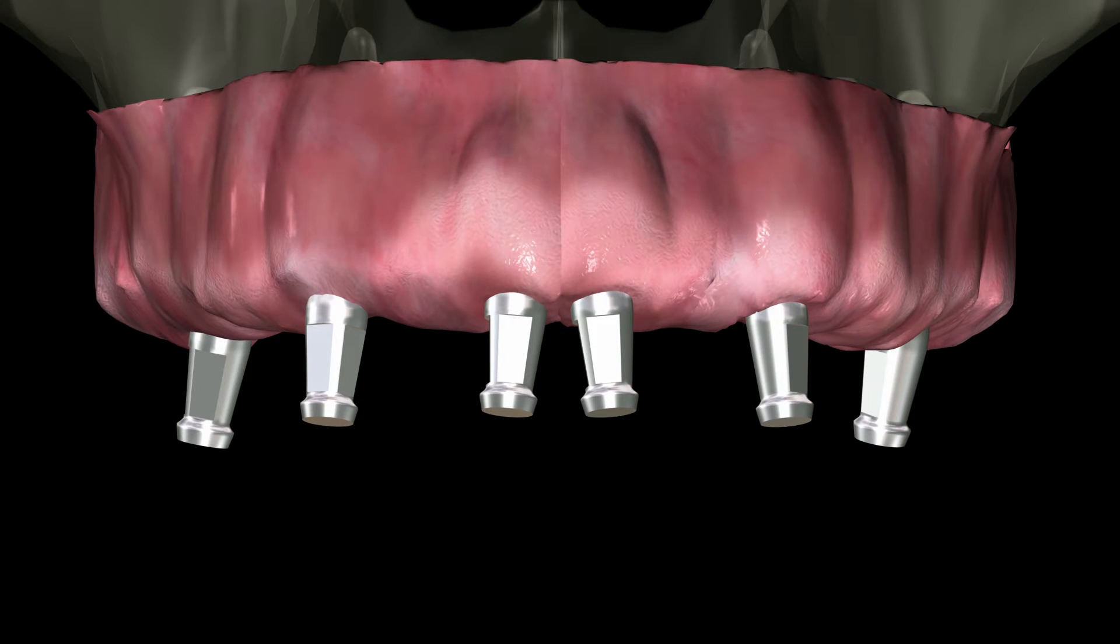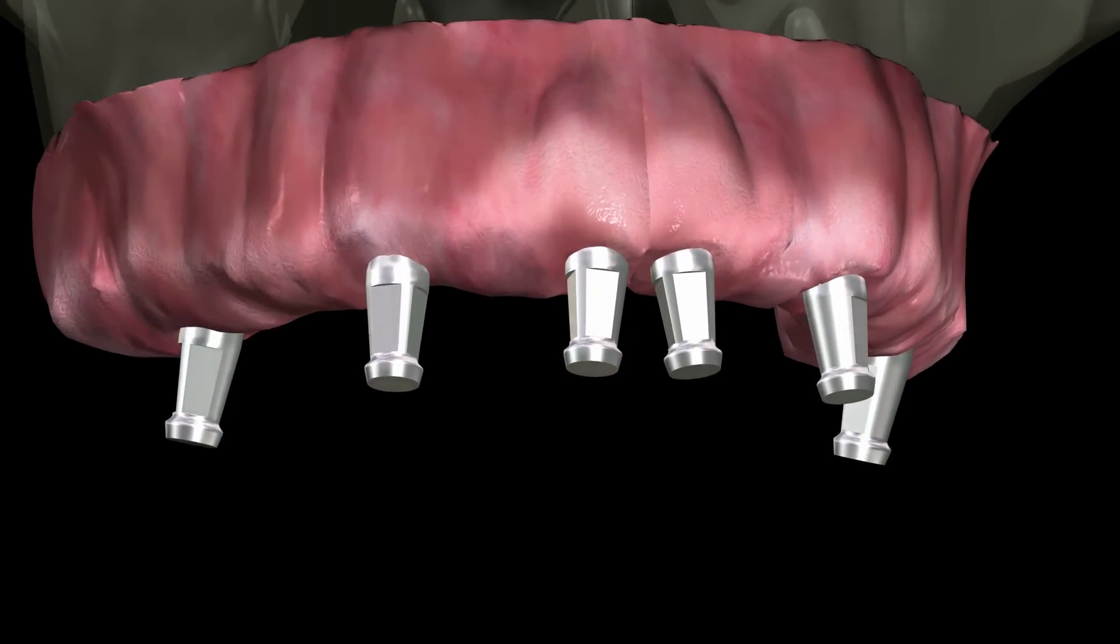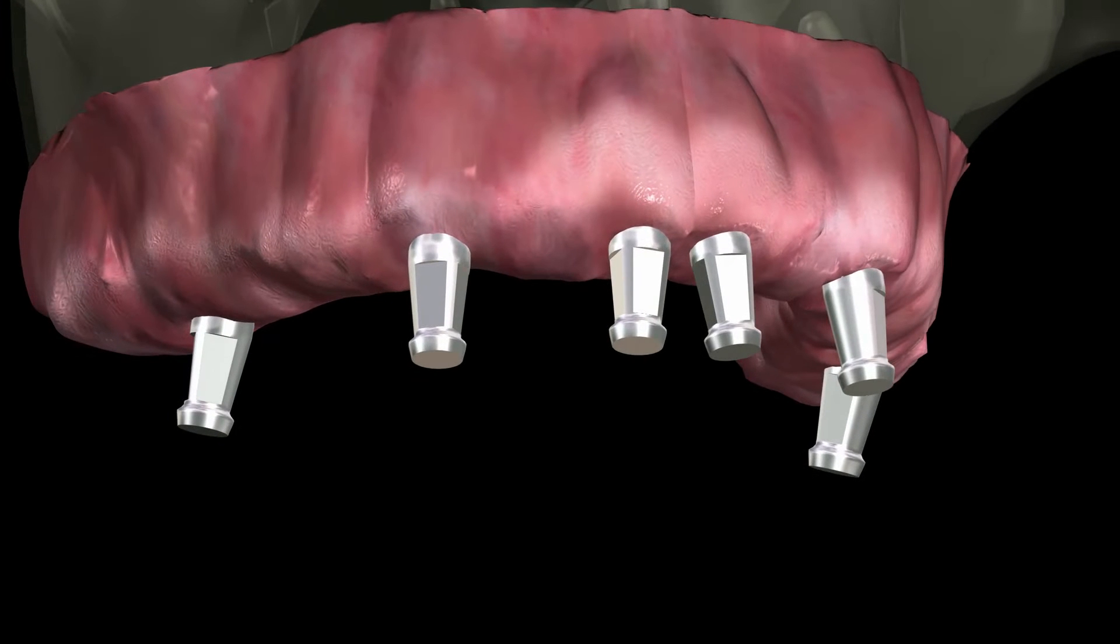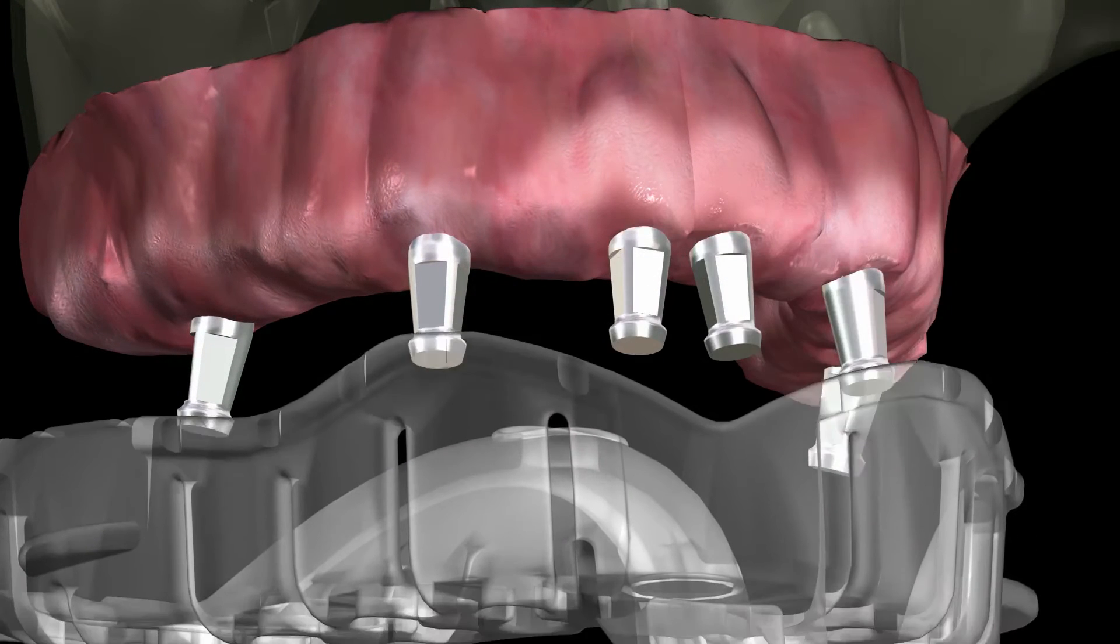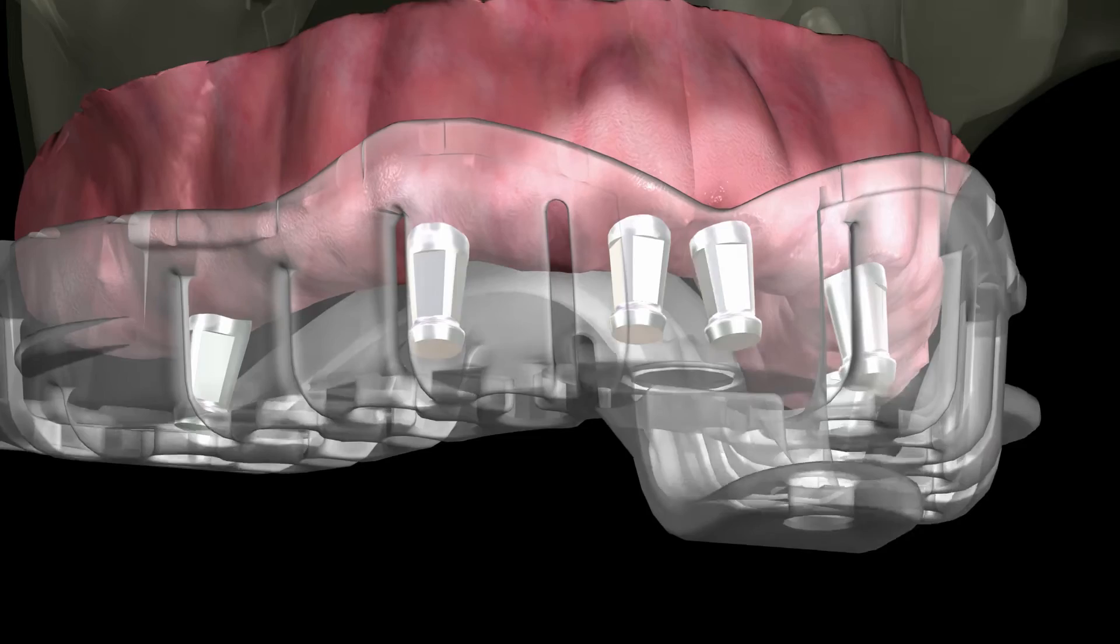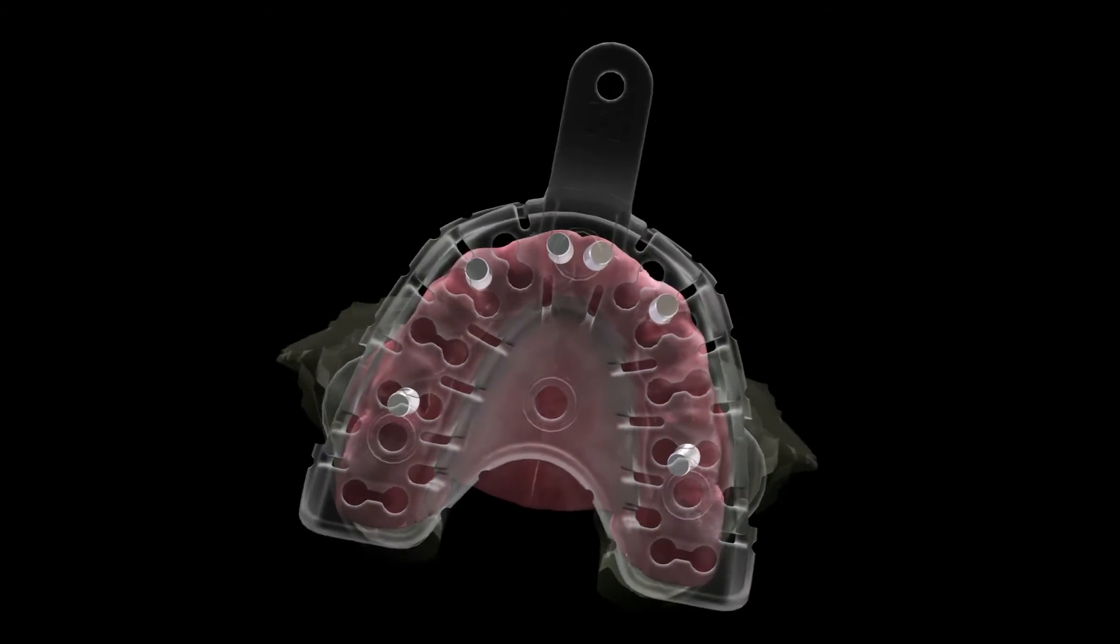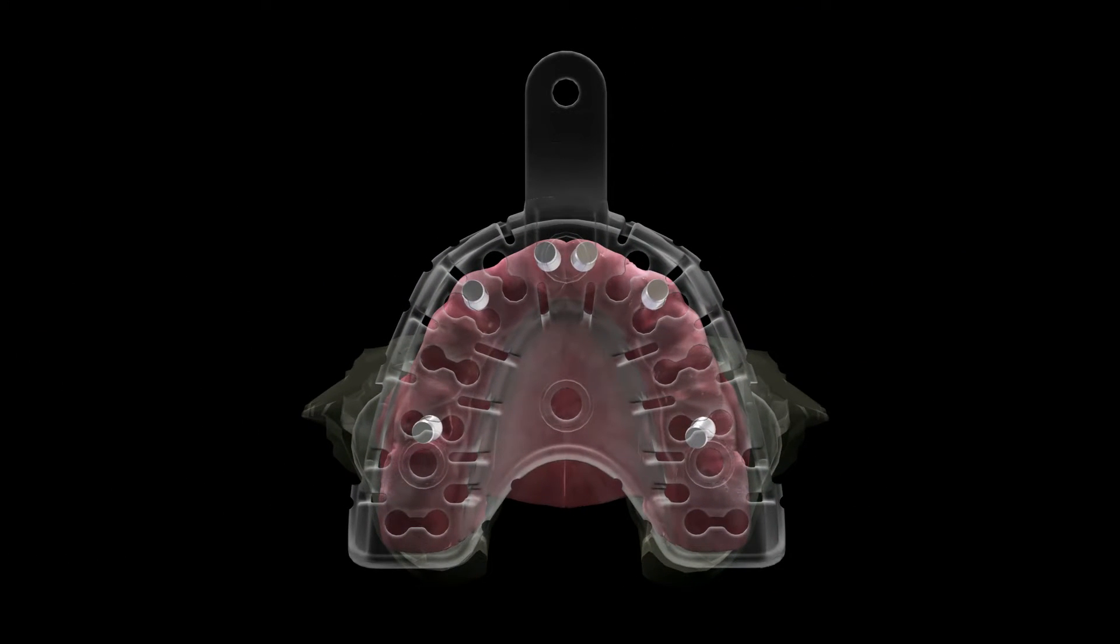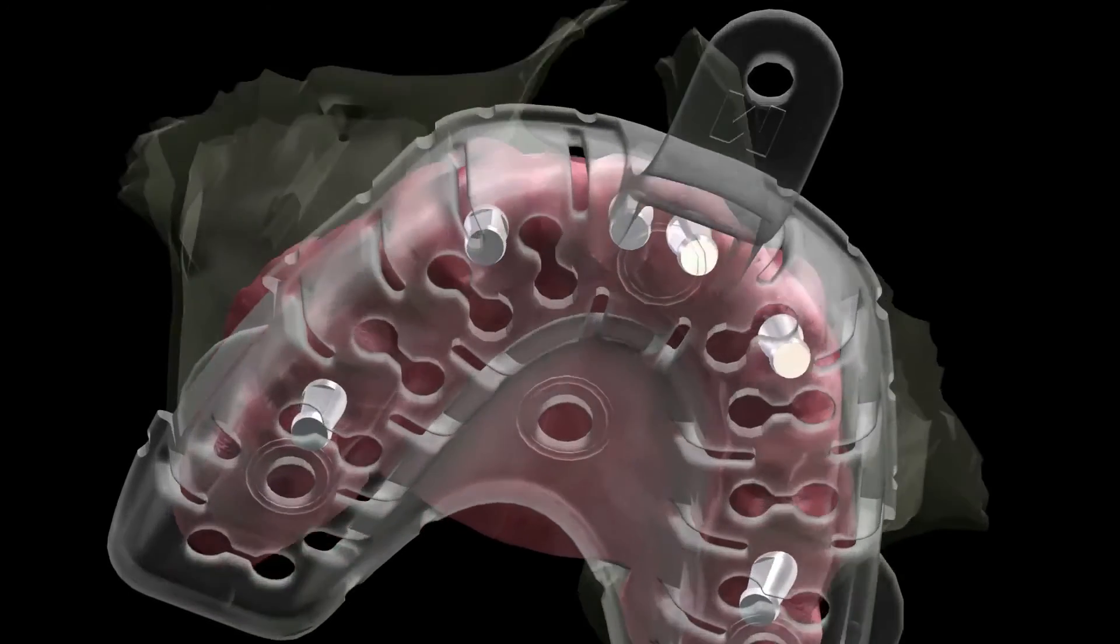Once the impression copings are properly seated, begin to prepare the impression tray. Place an adapted clear implant tray centering the implant impression copings into the tray trough. Observe the implant coping centered in the tray.